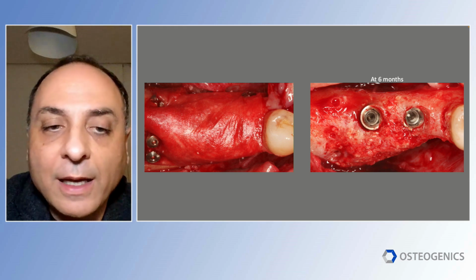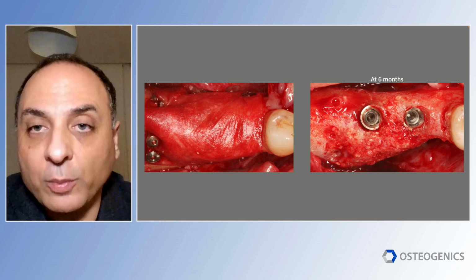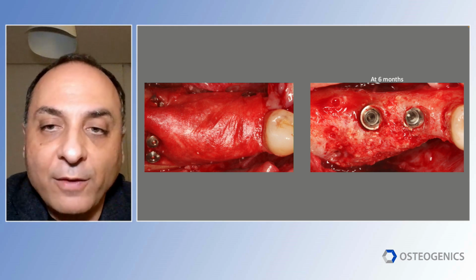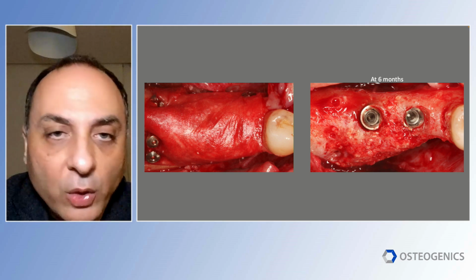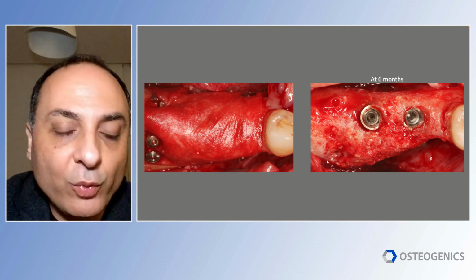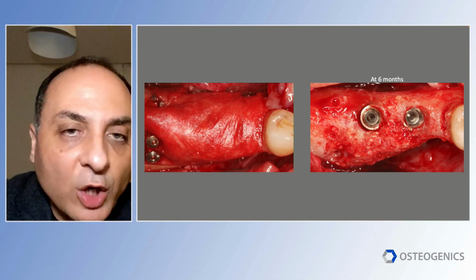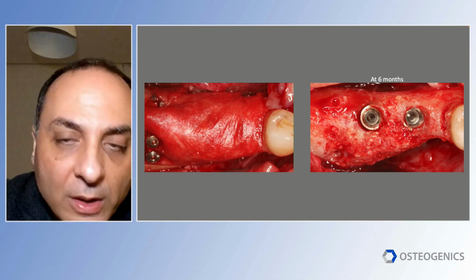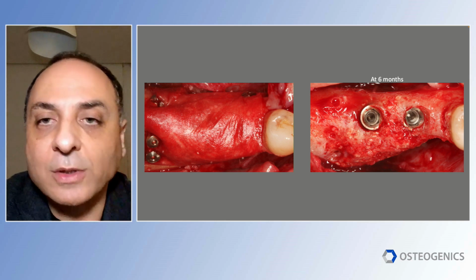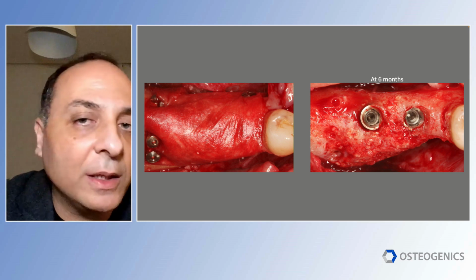Most of the graft that I have underneath this cross-linked collagen membrane is transformed into bone. This is something that I've never seen before, not with Geistlich, not with any combination. Even with the regular sausage, you lose. It's not documented, it's not published, but I trust that you lose because I use it from time to time just for the sake of curiosity. Sometimes you lose 20, 30%.